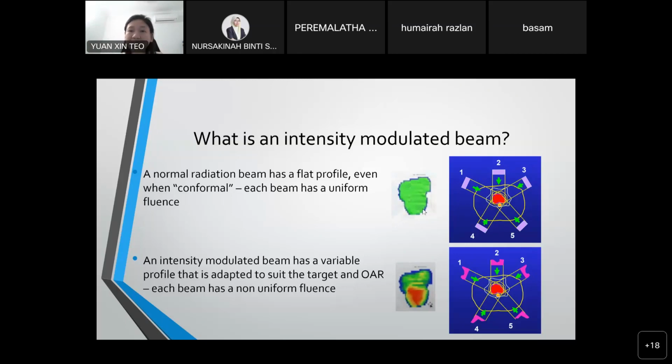maps. While for intensity modulated beams, as I mentioned just now, the MLC leaves will move during a gantry position. This means inside beam number 1 there may be a lot of small fields. Like in the previous lecture, I taught you the field-in-field technique.